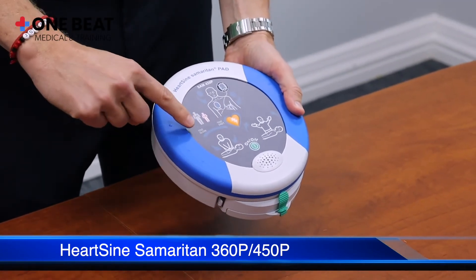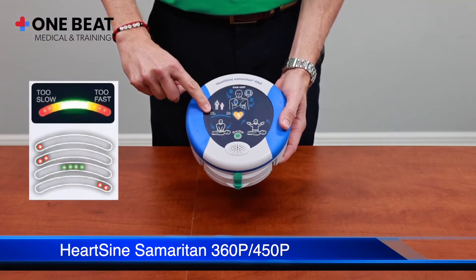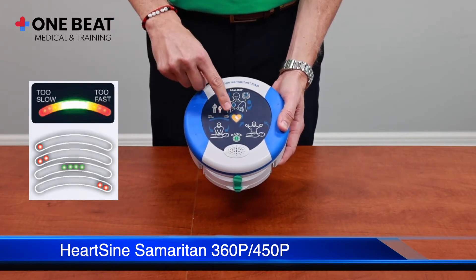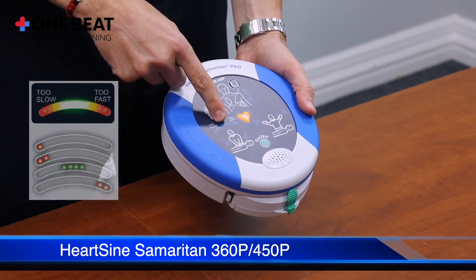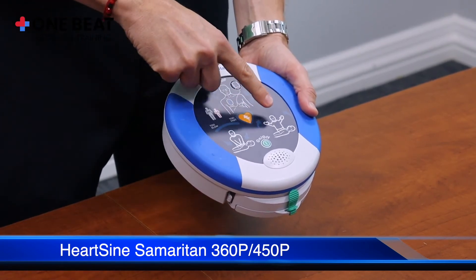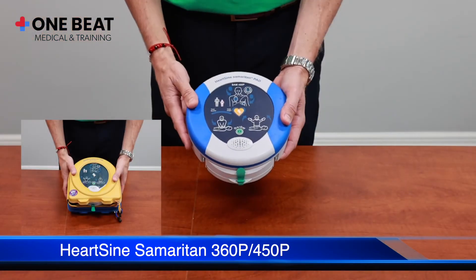On the 450p, you have the too-fast and too-slow indicators. During CPR, the device will tell you if you're going too slow or too fast. If your compressions are just right, the light will illuminate in the middle. You also have graphics that show where you are in the rescue process.